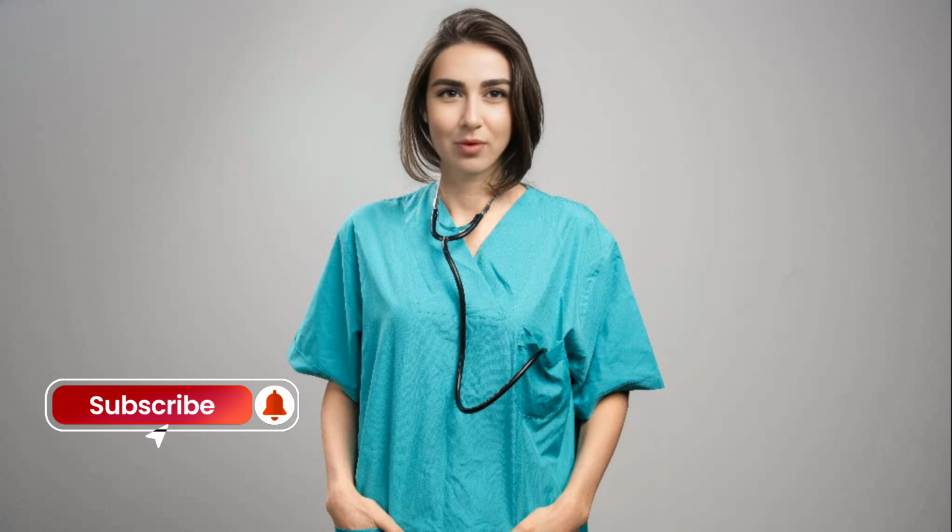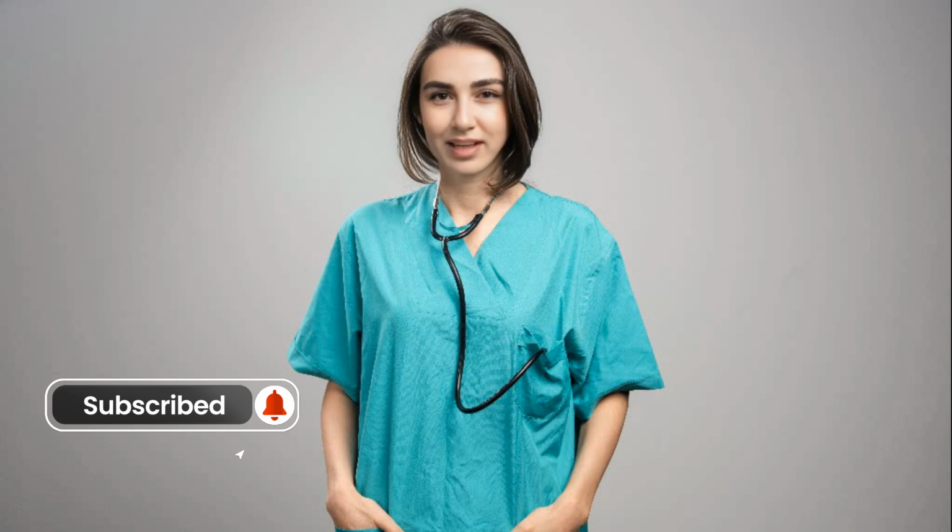4. Final balloon deflation and removal. After the artery is opened, the balloon is deflated, and all catheter equipment is removed. Pressure is applied to the insertion site to stop bleeding, and sometimes a special closure device is used to seal the puncture. 5. Monitoring and post-procedure care.